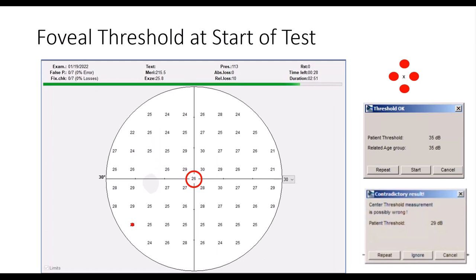One other key point is that there is a foveal threshold testing that begins at the start of the program. If your patient isn't clued into this and looking into the center of the four red dots, they'll miss the initial light stimuli presented to get the foveal threshold. This helps the perimeter identify what the hill of vision is — the patient's overall visual field. If the foveal threshold value is well below normal range, you may want to repeat it and make sure the patient understands the instructions, because if this value is off, the rest of the test may be off or take a long time to get back on track.